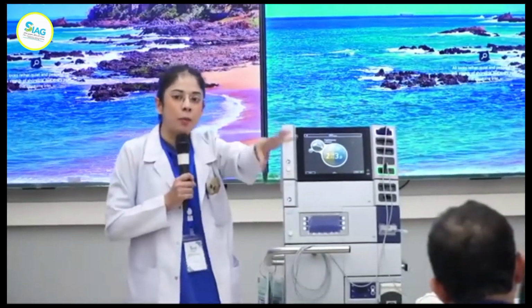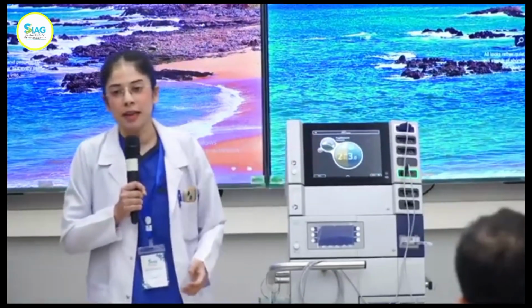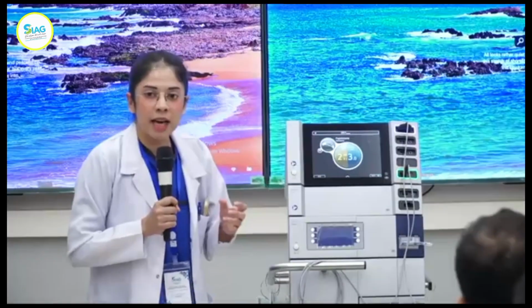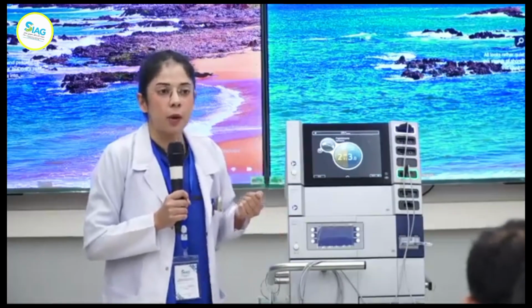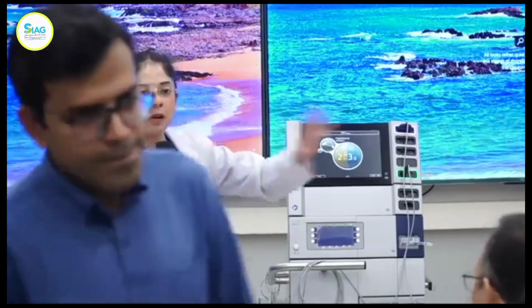But just a briefing. There are some misnomers in literature, like when they say vaporization in electrosurgical units. Most of the articles you find that mention vaporization occurs at 100 degrees. Technically in English, vaporization means that you're completely eliminating all particles from a substance, usually what they show in sci-fi movies. But vaporization in this context basically means reaching the boiling point of that tissue for the water to evaporate out. So it's one step behind carbonization, which is basically complete charring of the tissue.